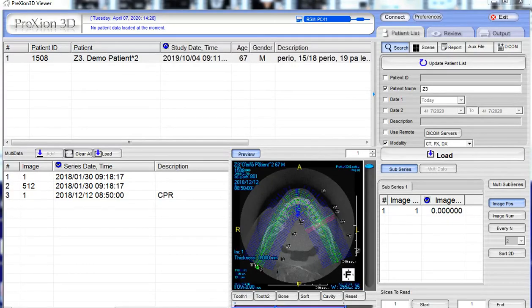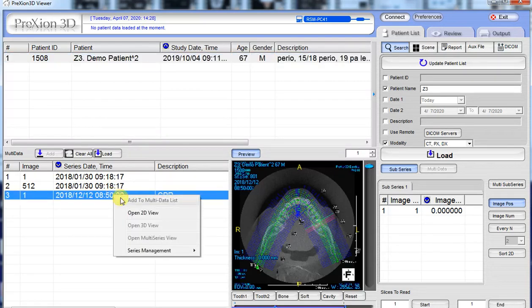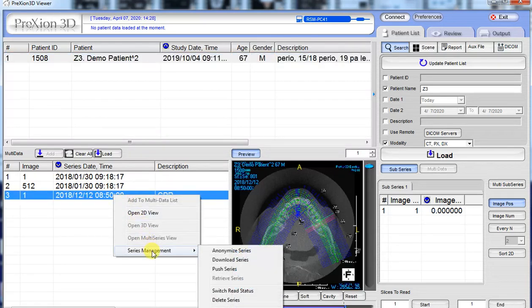Also from the patient list page, you can delete a scene. When you highlight a patient, everything in the series list is related to that patient. If something was saved as an additional scene and you want to delete it, highlight it, right-click, go to Series Management, go down to Delete, and the same principles apply.